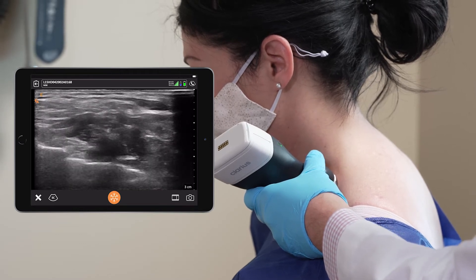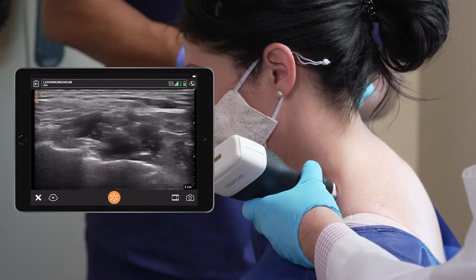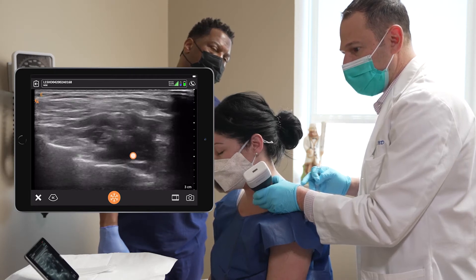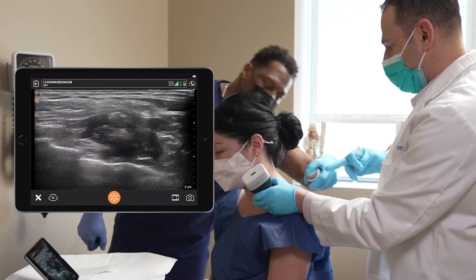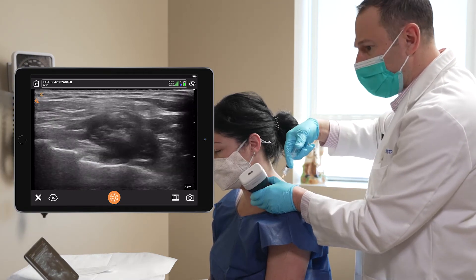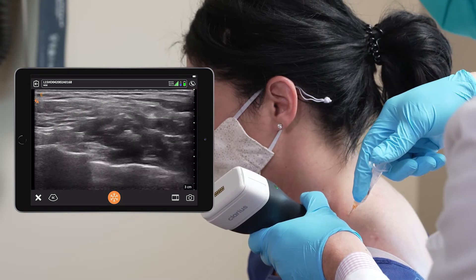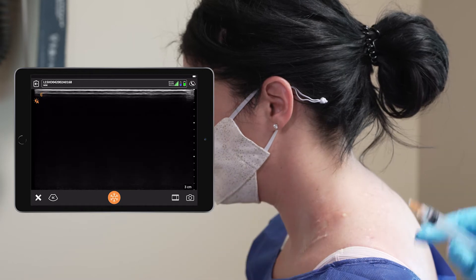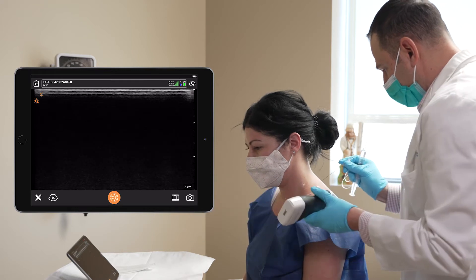I'll tell you when I'm going to do a pinch. I'll come to this side and spray her. See the nerves around the subclavian artery — I'm going to give her a little injection over here first. A little pinch. Your skin is numb — you hopefully won't feel too much now.